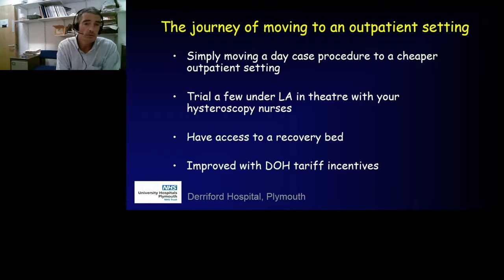So our journey moving to the outpatient setting, we did this in about 2013. We were already performing NovaSures under general anaesthetic, and it was working well. And it was put to us that perhaps we could perform it in the outpatient setting. And I think we did start with a bit of trepidation, thinking the pain scores would be quite high. But we made the leap.